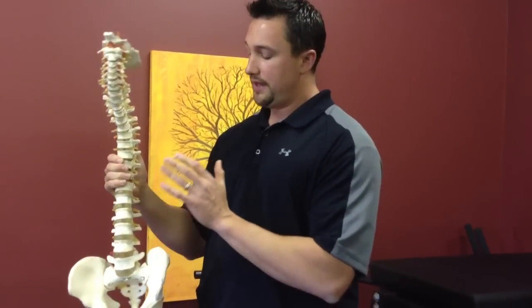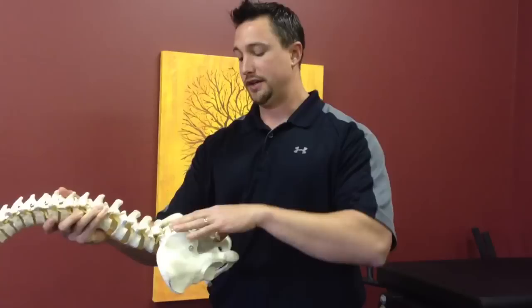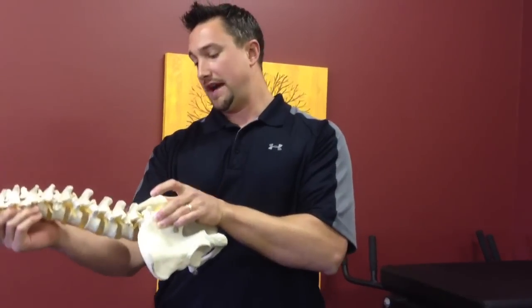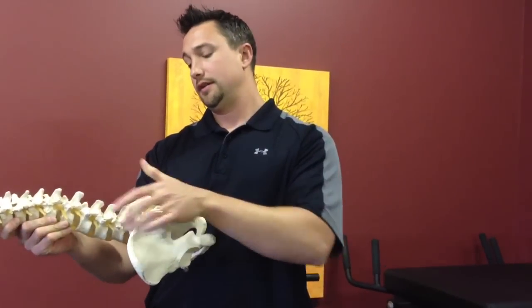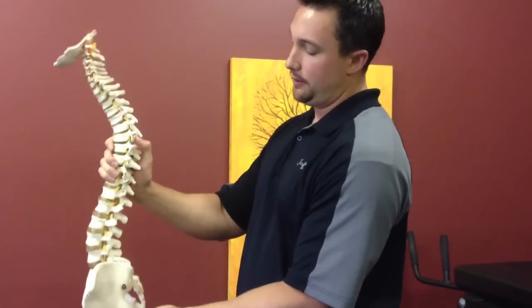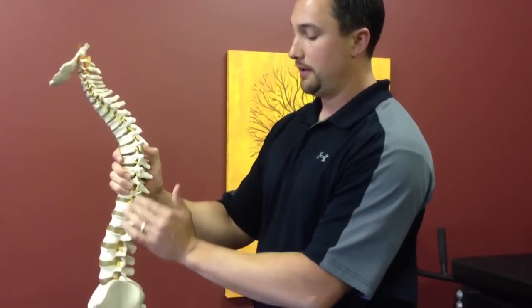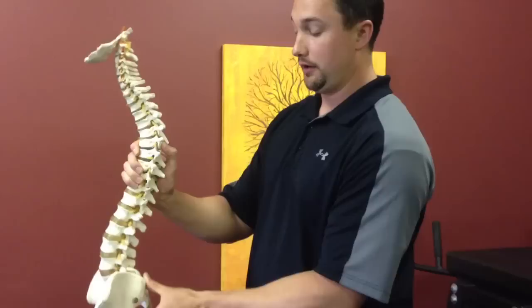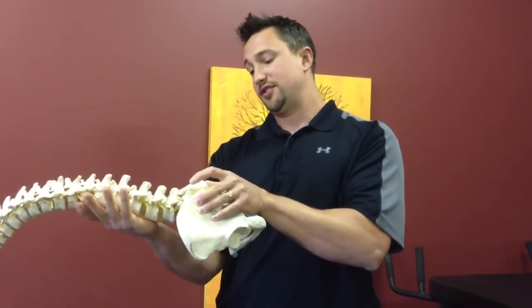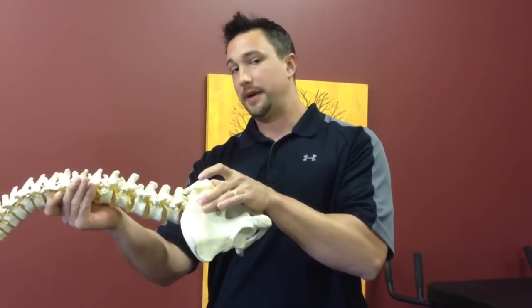When you do spinal decompression, you're generally going to traction out the spine. What happens is the traction actually flattens out the lordosis. The lordosis is this curve in the low back — right through here — this is your lumbar lordosis, or that posterior curve. So you lay down, apply traction, it's going to traction that out. And generally, that straightening of the spine is what goes on with spinal decompression.